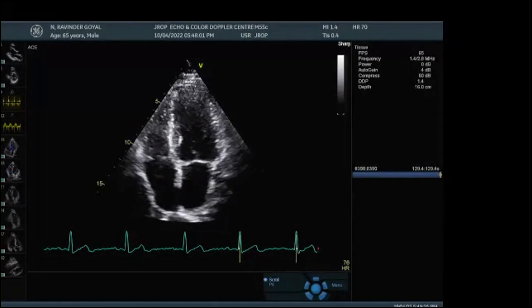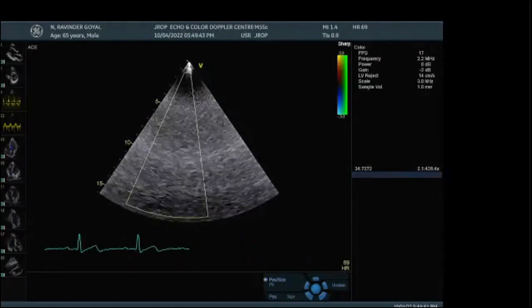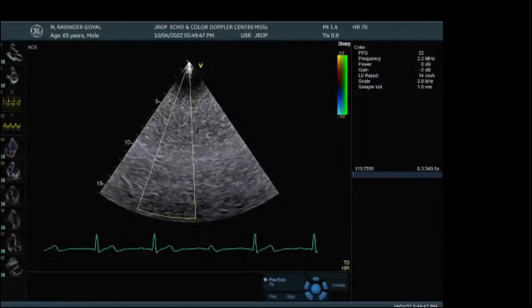Sir, I have one question. There is a color limit, and there is a green color. Is that compulsory? Because generally when we do echoes, we use only blue and red color. Look, Jigna, what exactly you are saying, I'm going to come to that.